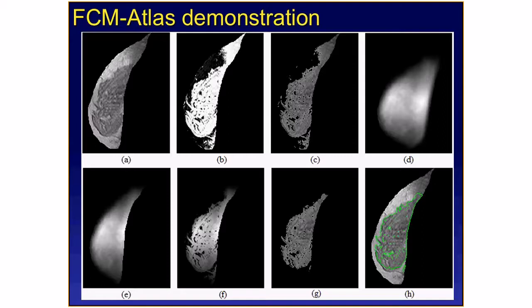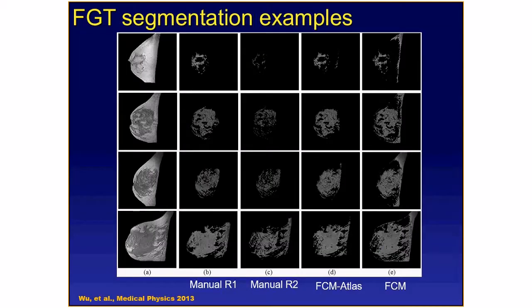So those are the input images, and then after several processing steps, you get the images here. Look at it. Sometimes you think these are all just simple to find this area, but it's actually not. If you look at the intensity, for example, it's very close to here, but those are biased fields, so it's not part of the breast dense tissue.